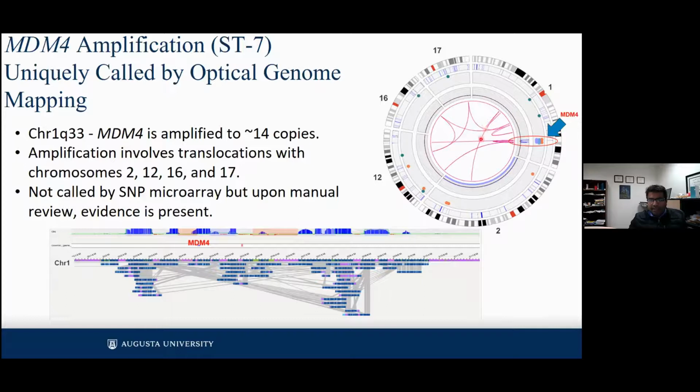I think this is another very interesting piece of information which we have identified in this particular tumor. The panel on the bottom shows multiple abnormal fusions of chromosome 1 involving and around the MDM4 gene. We're still investigating the clinical relevance and importance, and even the existence, of these translocations, not only in brain tumors, but also in other solid tumors.